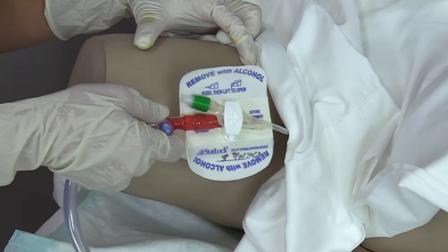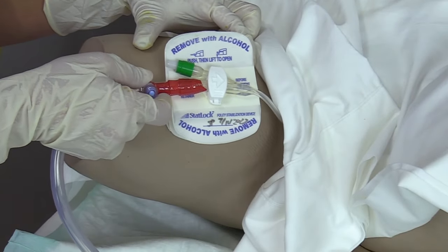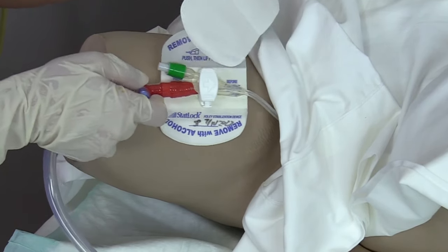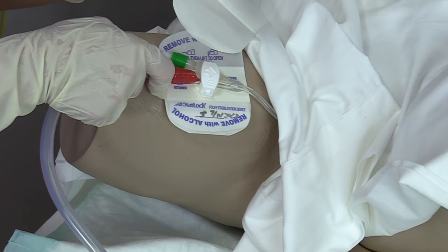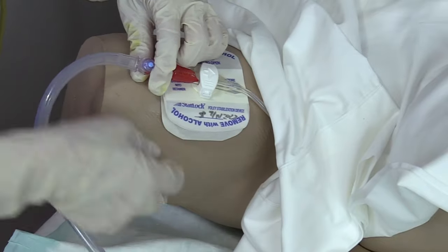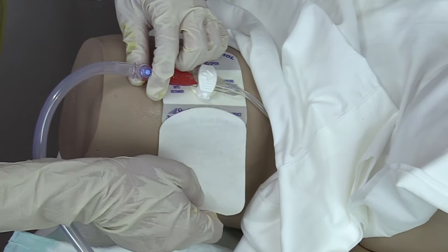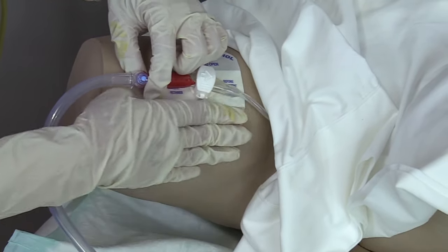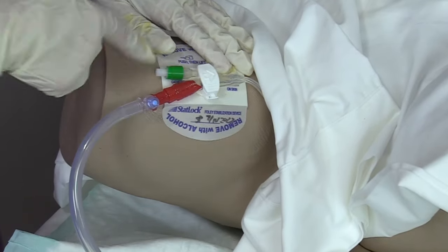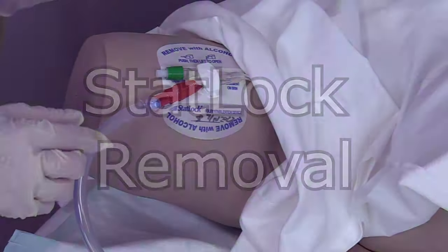Now that it is dry, we're ready to place the STATLOK on the skin. We are going to pull back one side of the adhesive and place that on the skin and rub it down. Then pull the other side back off, put that on the skin and press it down. Confirm your arrow is pointing towards the insertion site.